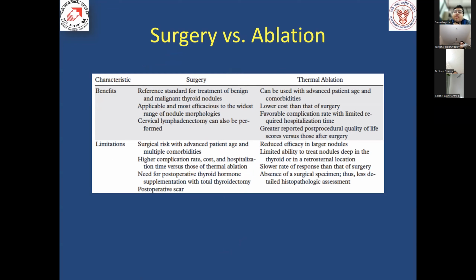All these things are because it is an organ preserving treatment. We would essentially leave the thyroid behind and treat only the tumor. So overall outcome in that case is better than surgery. But again, that is a very small subset which we can treat by ablation, and not everything that comes is for RFA or microwave.